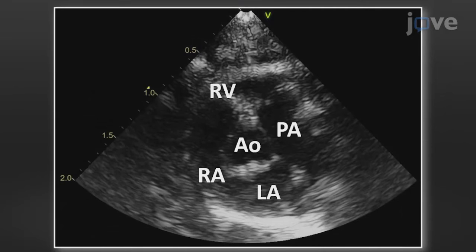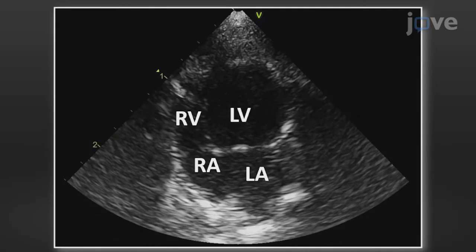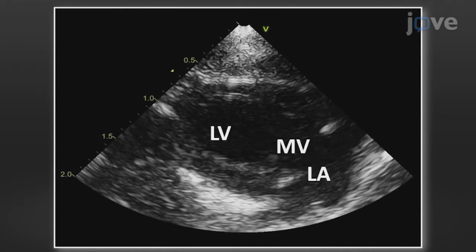The parasternal window short-axis view allows visualization of the right ventricular outflow, the aortic valve, the pulmonary artery, and the left ventricular mid-cavity size and function. In the apical four-chamber view, all four-chamber dimensions and the function of the left ventricle can be assessed. The apical two-chamber view focuses on the left atrium and ventricular size and function.